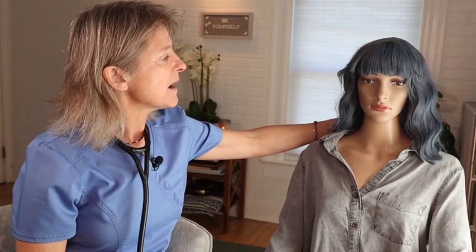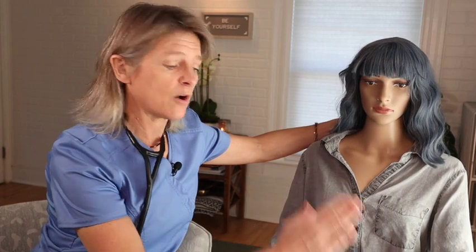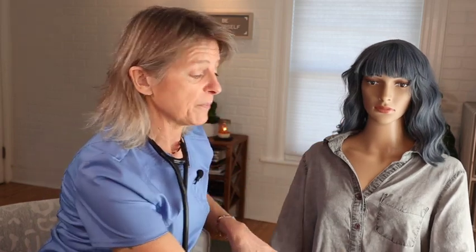Sometimes the patient may lean forward depending on where you're listening to heart sounds, or they may be lying on their left lateral side. But for the purpose of this video, we're just going to allow Jade to sit up. She likes to sit up. She stays there. She's nice and put, and she's happy just like that.